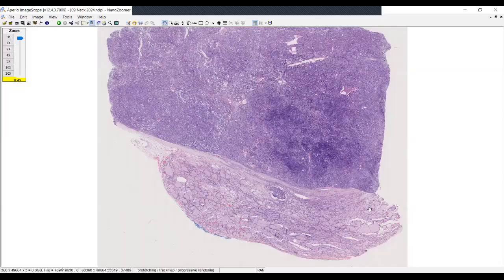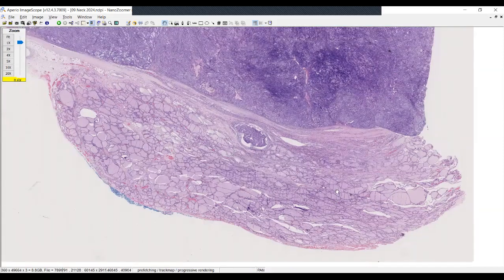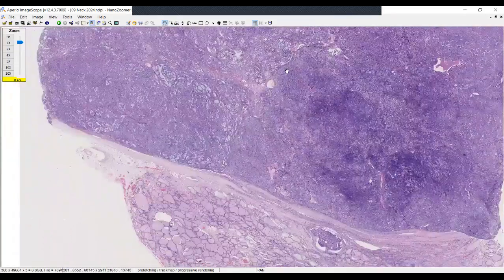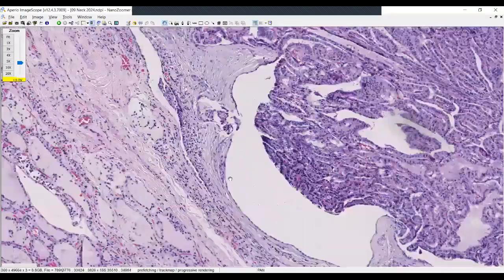Let's go and look at the lesion, and here you can see an example of the digital slide. So immediately you can tell we're in thyroid now, still part of the head and neck, of course, but I had to throw in a thyroid lesion for good measure. Here is the thyroid parenchyma, and then here is a fairly sizable tumor that is filling much of the space. I think there's also extension here, but let's look at that more closely.